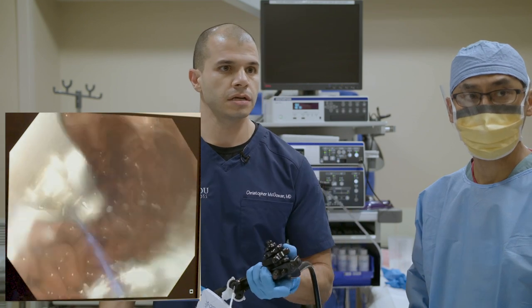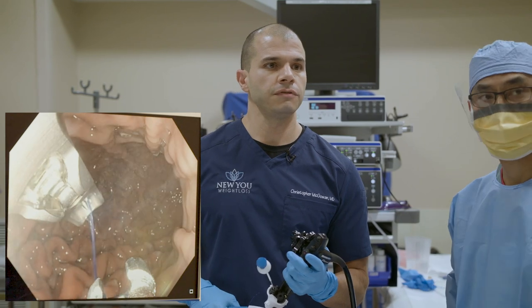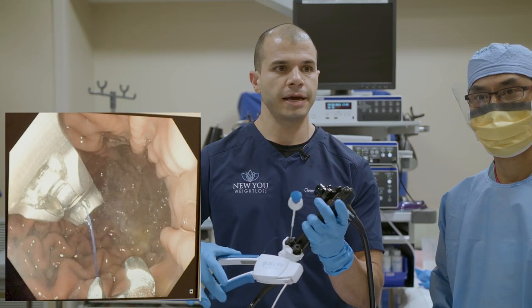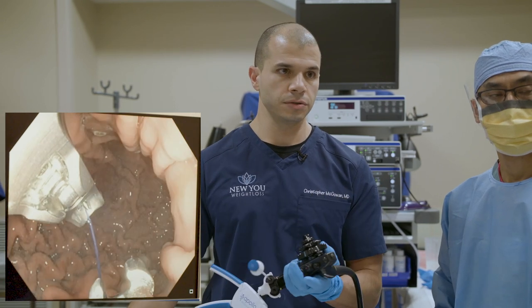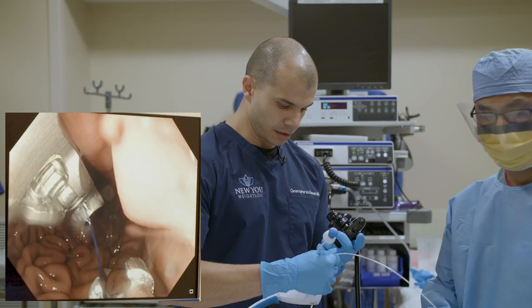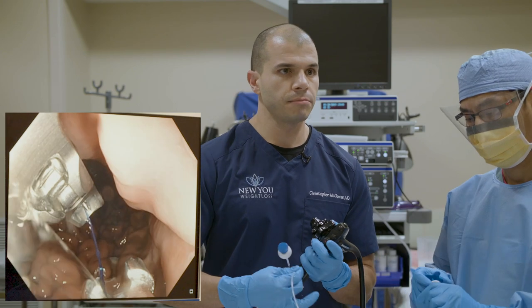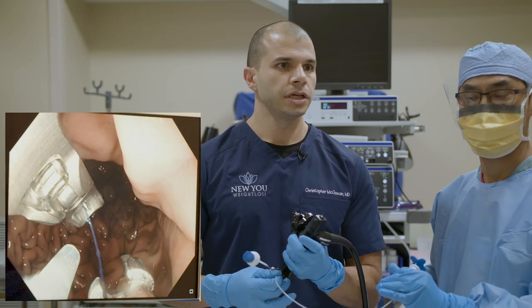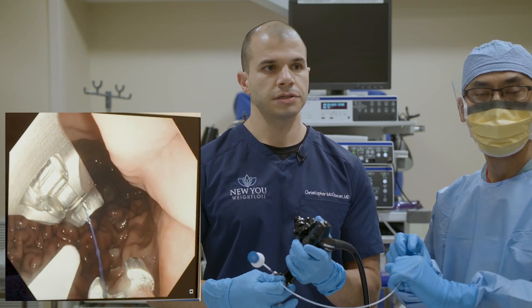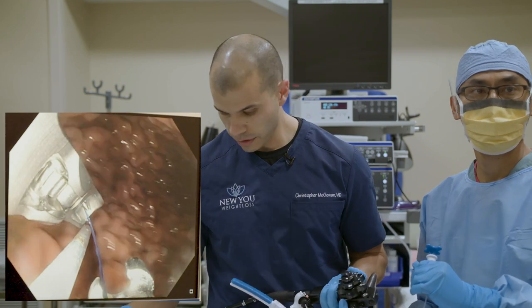If you have any questions or comments, please type them in and we'll field those. You can see our needle in view — I'm squeezing the handle and passing that needle to suture. We're also loading through the scope something called the helix, which is basically a small corkscrew. That's going to allow us to grab the stomach tissue and pull it towards the scope so I can then pass the needle through it.